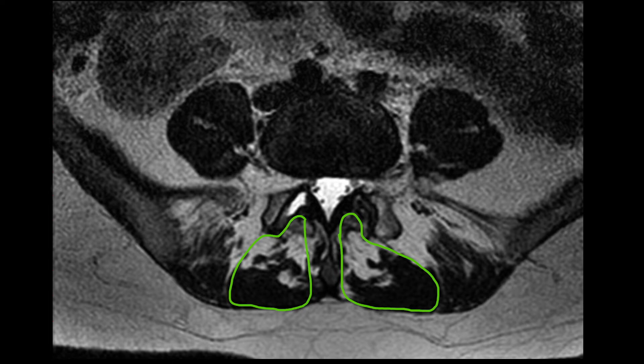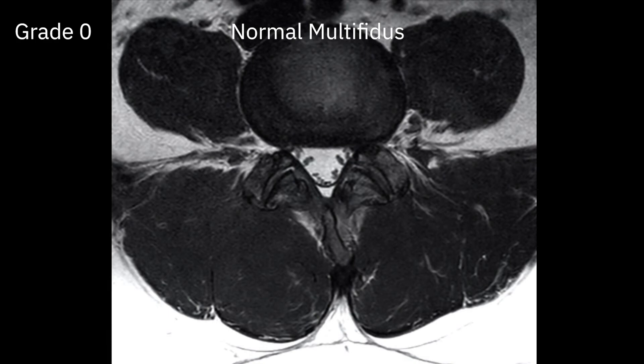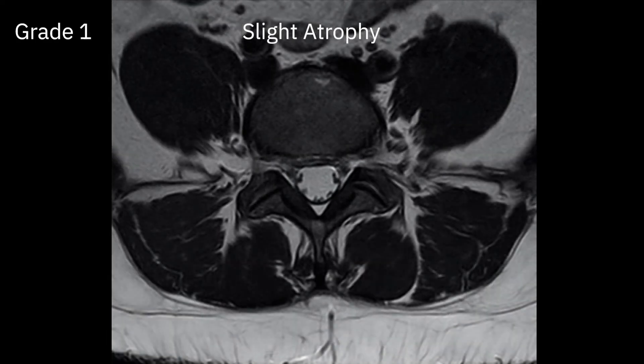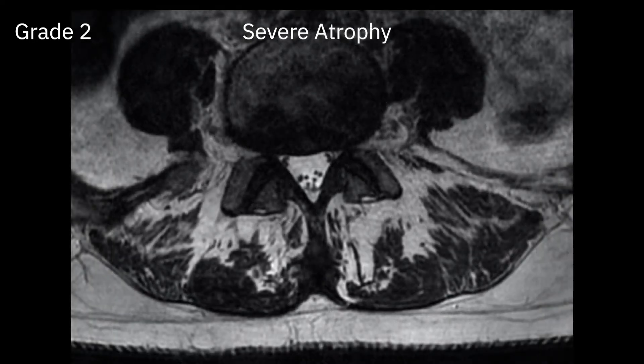While it is important to assess the muscle globally, I also look specifically at the deep multifidus. We know from the literature that the most medial part of the muscle is responsible for the bulk of the work required for intersegmental stability. One of the best studied and hallmark signs of a degenerated multifidus is fatty infiltration. Although the muscle may also be dysfunctional without the accumulation of intramuscular fat, there is high quality literature that shows a positive association between intramuscular fat, multifidus dysfunction, and low back pain.